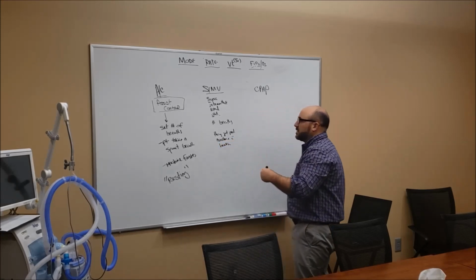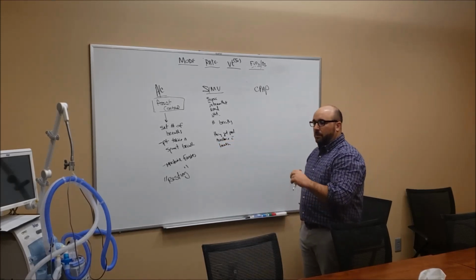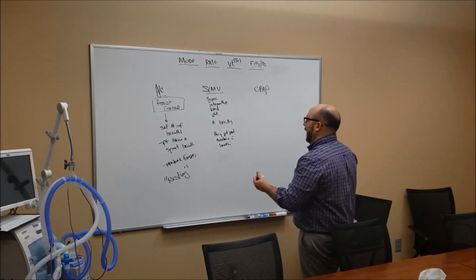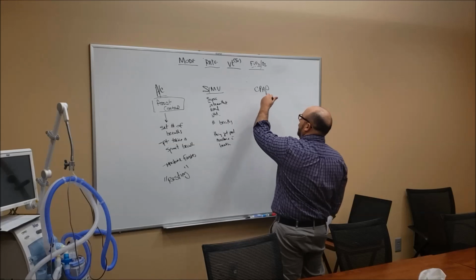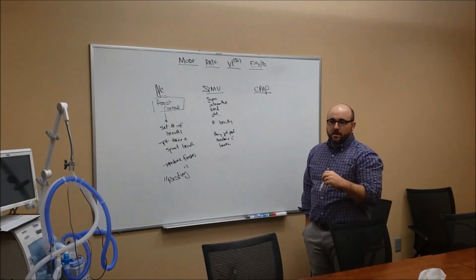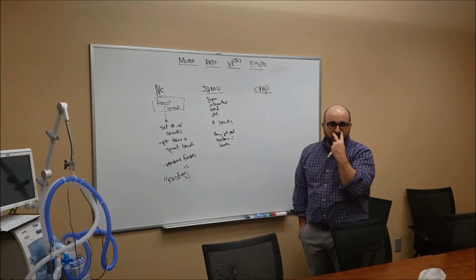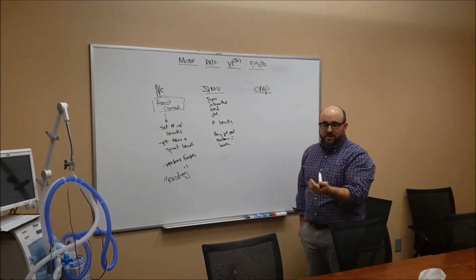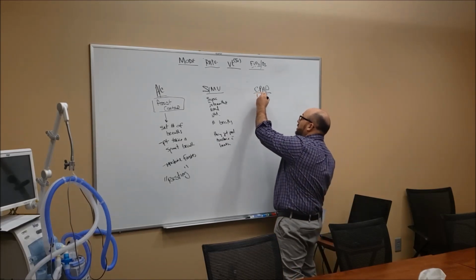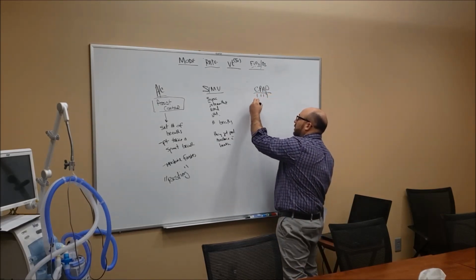So we give them so many breaths. If they take their own, we give them a little bit of help, but they've got to do a little bit of work. So we're allowing them to do a little bit of work, and it's a nice combination between the final mode. So what does CPAP stand for? A lot of people wear CPAPs at home at night, and it's for obstructive sleep apnea. You got that one pressure going in. Continuous positive airway pressure.